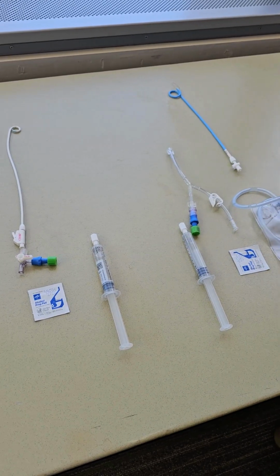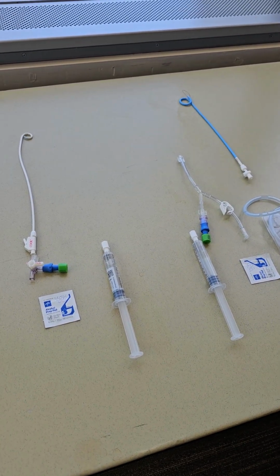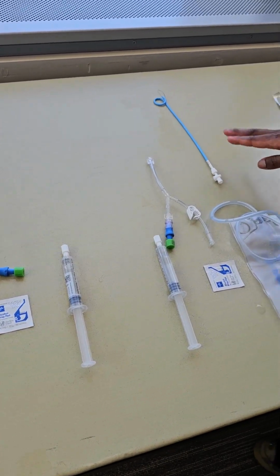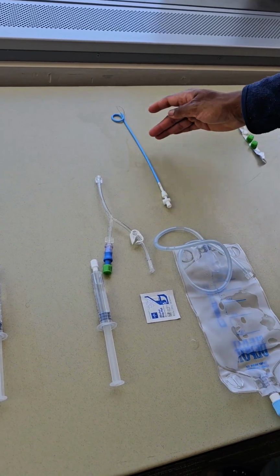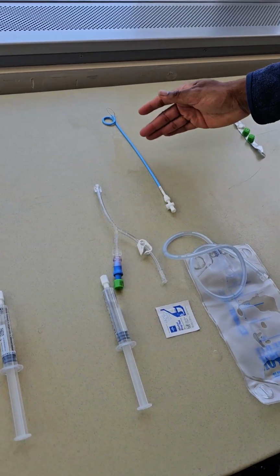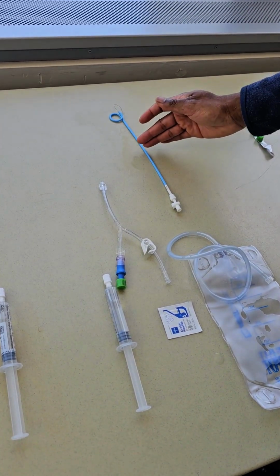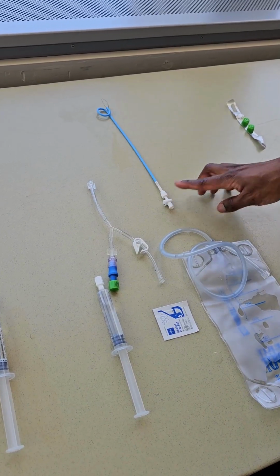So your drainage system is typically going to come with three major components. The first component is your actual drain. This is a pigtail drainage system. This shows what the drain looks like. Half of the drain is going to be in the patient, and about half of the drain is going to be sticking out of the patient. So this half is the part that you're going to see sticking out of the patient.